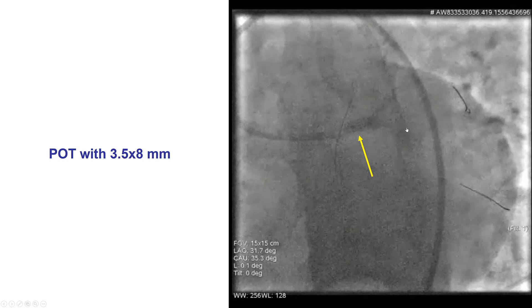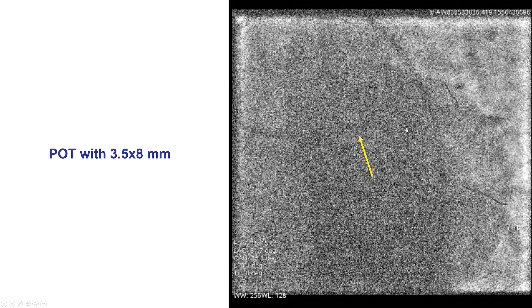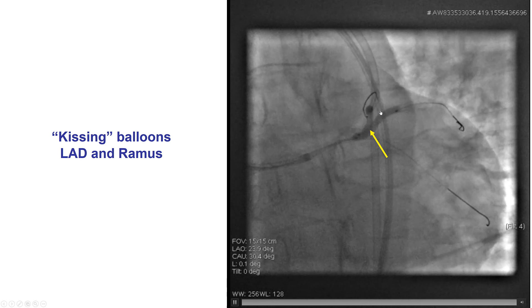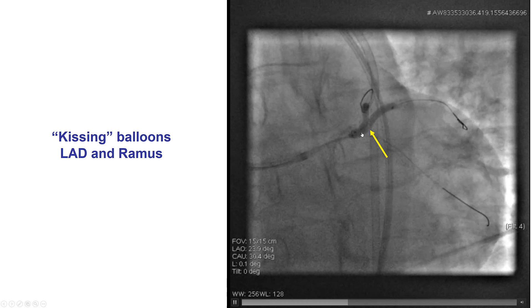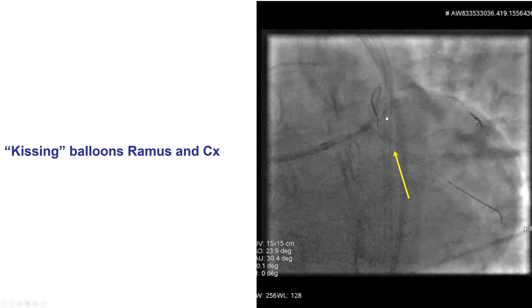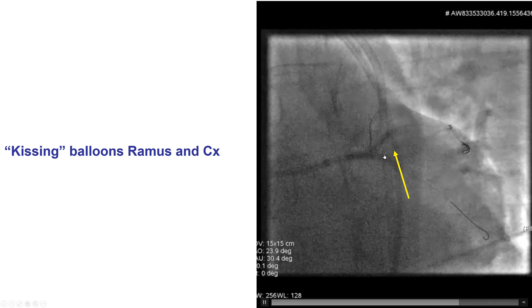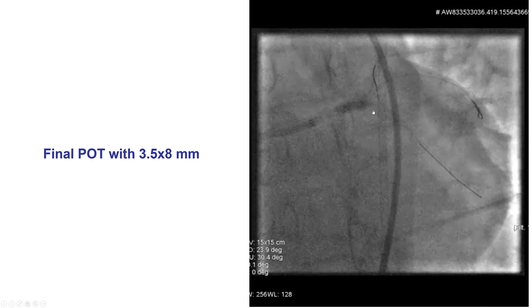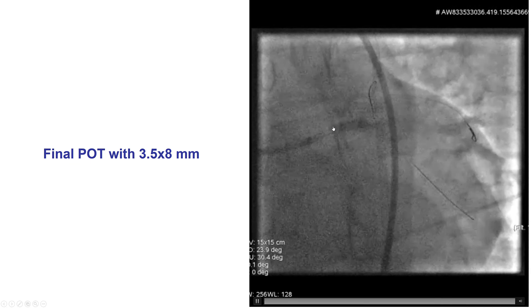We were able to predilate with a small balloon and then place an additional stent into the circumflex, performed the proximal optimization technique, and then did sequential kissing. We kissed into the LAD and the ramus, and then put balloons in the ramus and the circumflex and did kissing there as well. We finished with a final proximal optimization technique with a short 3.5 mm balloon.